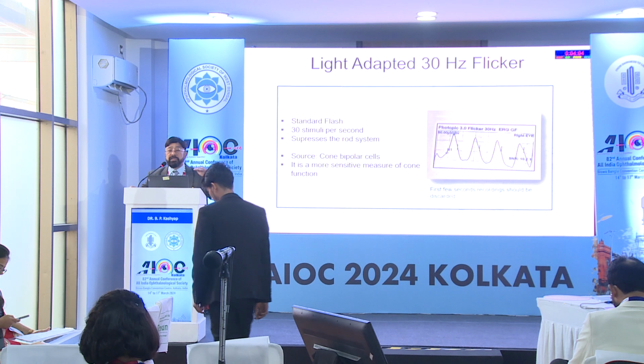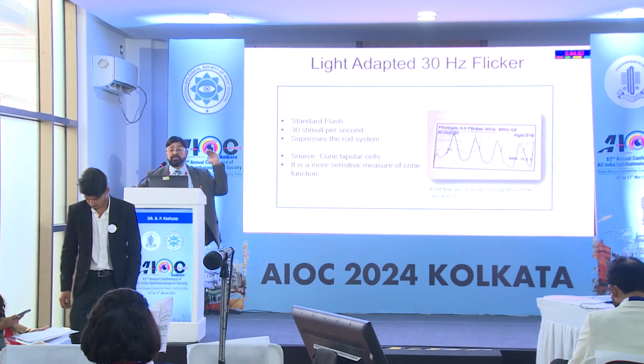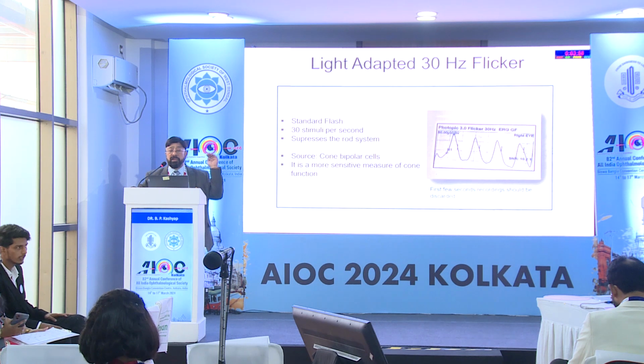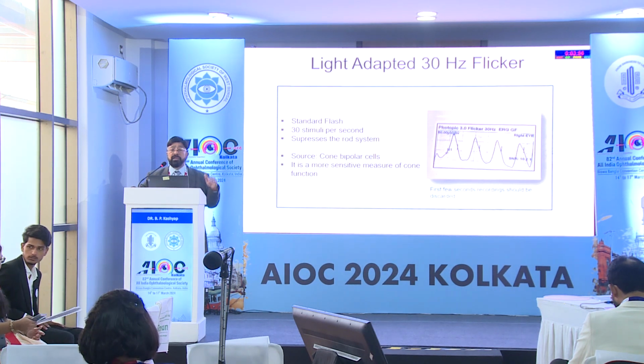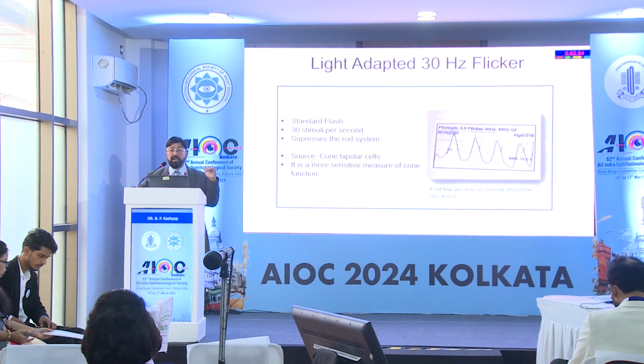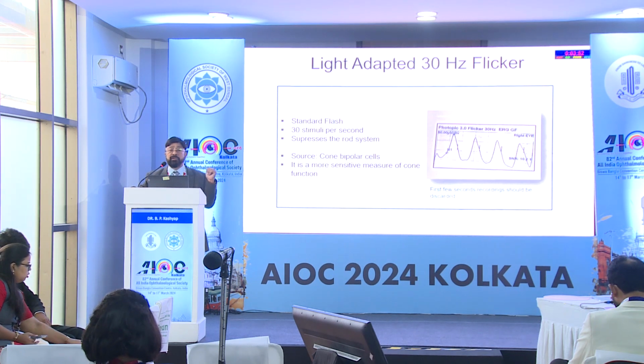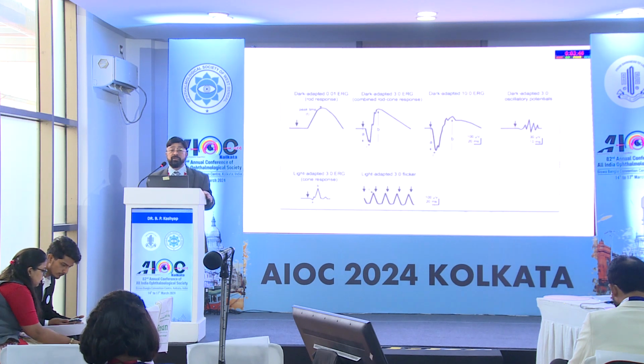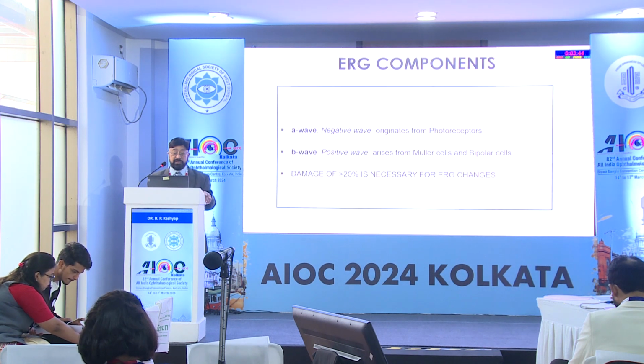So why am I saying this? Suppose you have a suspicion of rod dysfunction, you have to stimulate accordingly. Cone dysfunction, you have to stimulate accordingly. If you are only looking for whether there is any problem in the cone or not, you do the test accordingly. So these are the responses that you get from different tests.